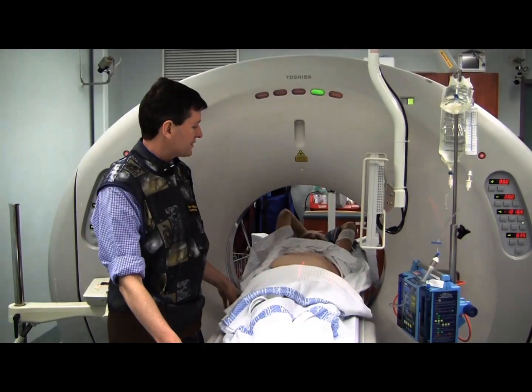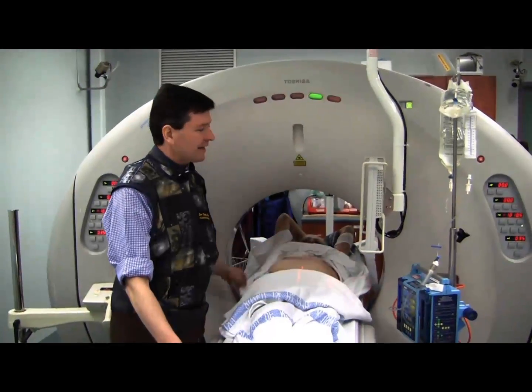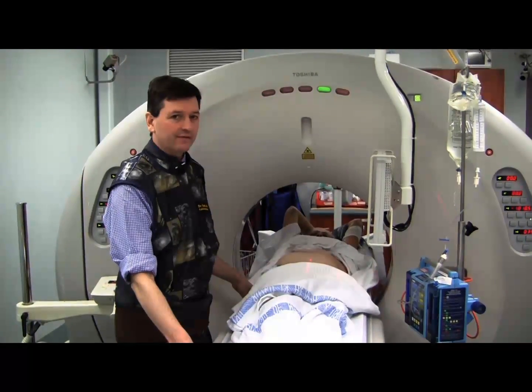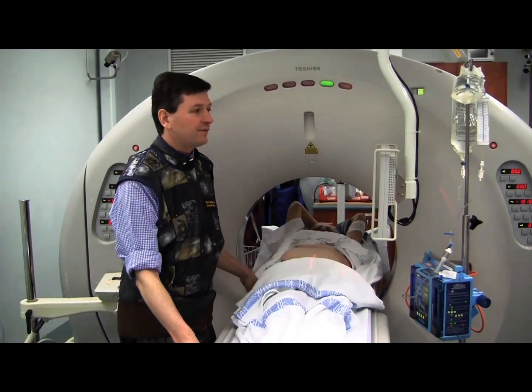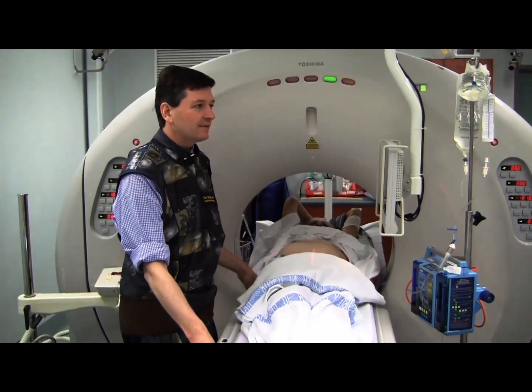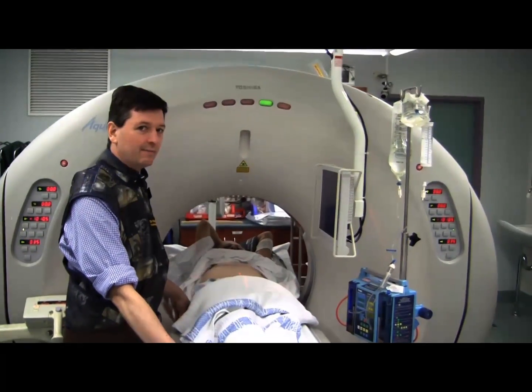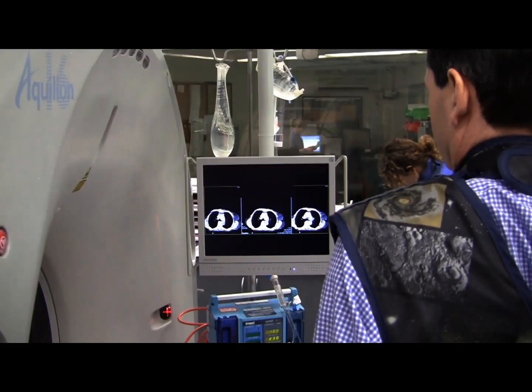Hi, we're just lining up now for this case. We've got the patient supine. We're proposing to come in somewhere down here, parasternal. We're about to have a look on the Fluoro CT where that exactly is going to be. First order of the day, however, now that we're in position, we've got consent, is to give some sedation. We're going to open the bidding here with 50 micrograms fentanyl, 2.5 milligrams of midazolam IV.